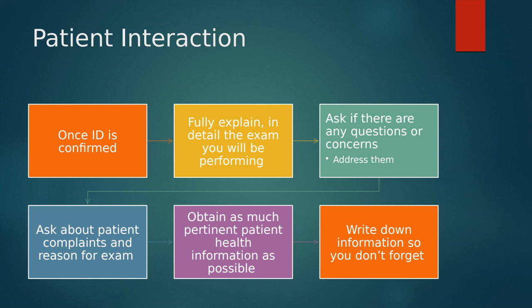Once we have them all set, ready to go, we have all the matching information, the exam's right, the doctor's right, the patient's right, we want to make sure that we are fully explaining the type of exam that we are going to be doing. Imagine if your doctor says to you, I need you to go for this test. You go for the test, they slap some jelly on your belly, and they don't talk to you, they don't tell you anything, and then they say, all right, have a good day. You're like, what the heck just happened, right?